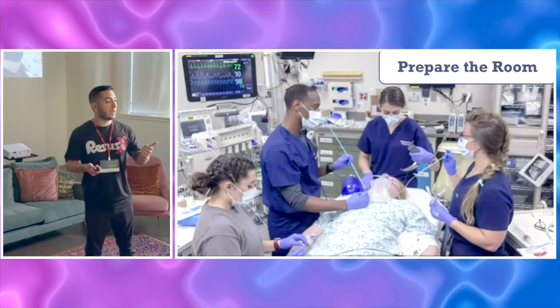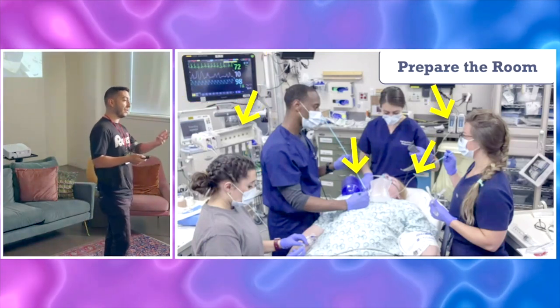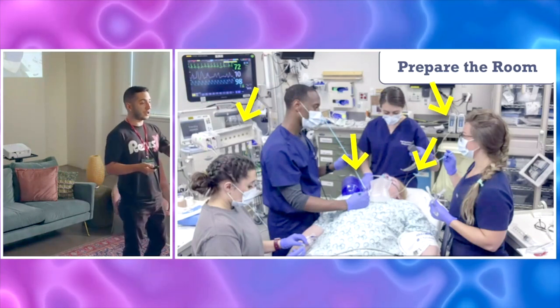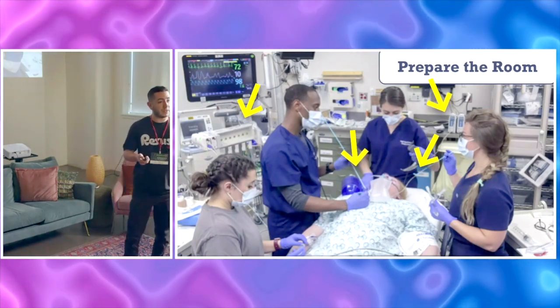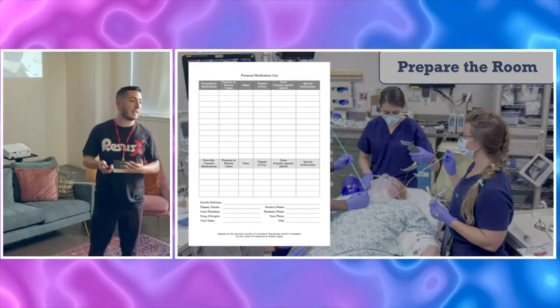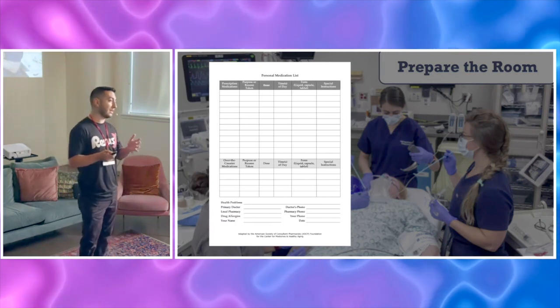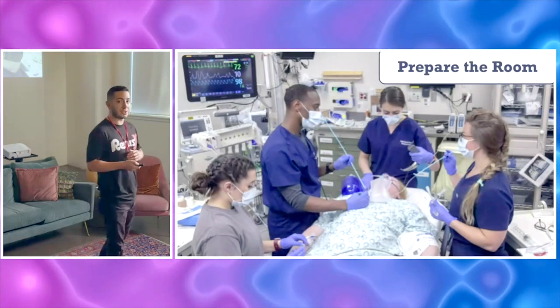So make sure that your patient's on the cardiac monitor, get supplemental O2, make sure all of your airway equipment is at the bedside, get your primary, your backup, your rescue devices, including any surgical airway equipment. And then have all of the medications that you need ready, including RSI medications, in case you run into any issues and you need to change strategies.